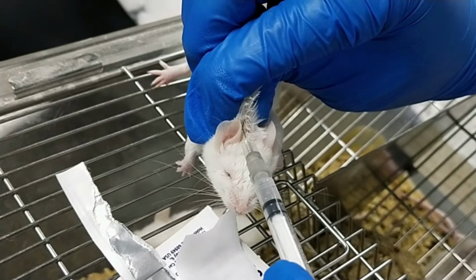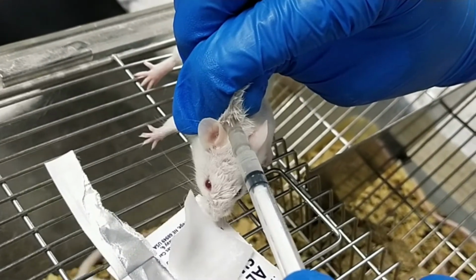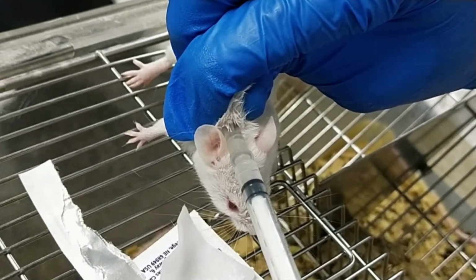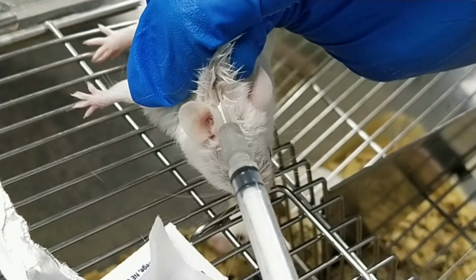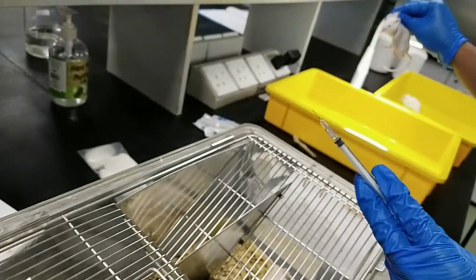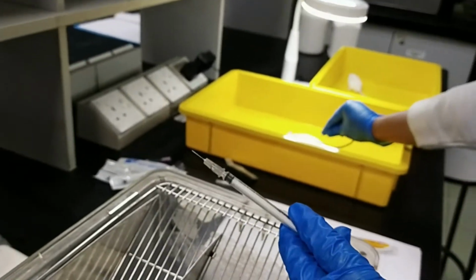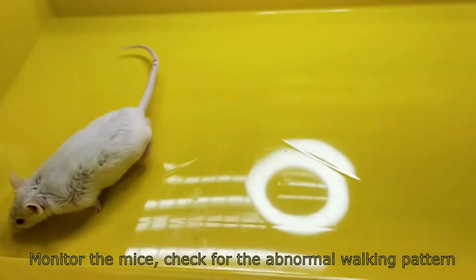You can feel the skin. Right, then we're going to transfer the mice into the tray as well. And then we need to monitor the mice for a few minutes until it loses their reflex.